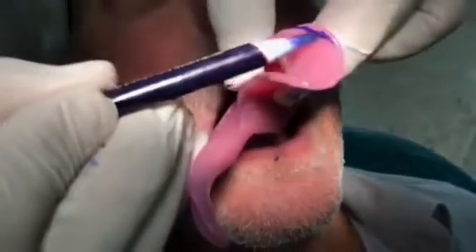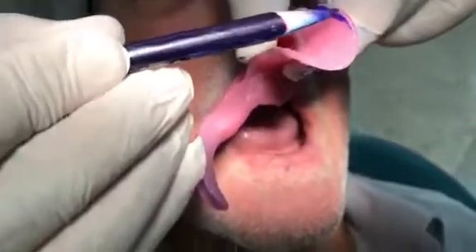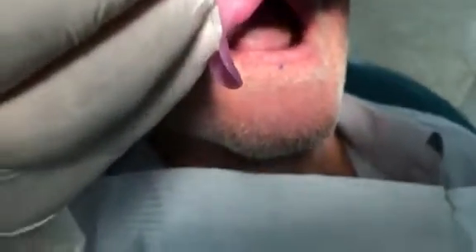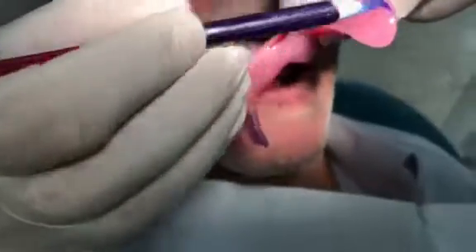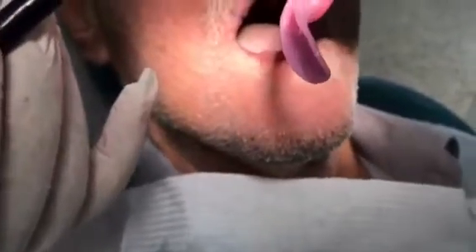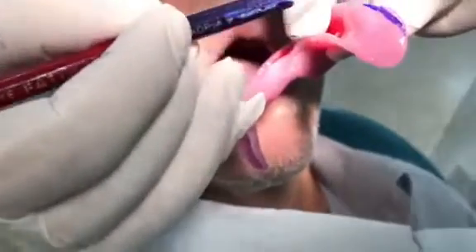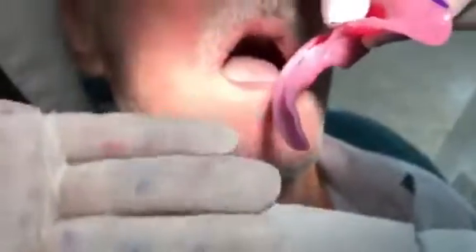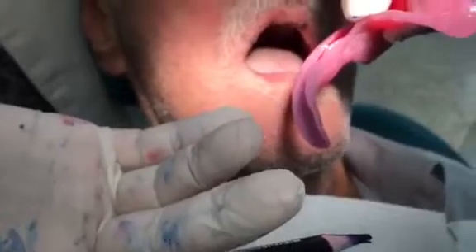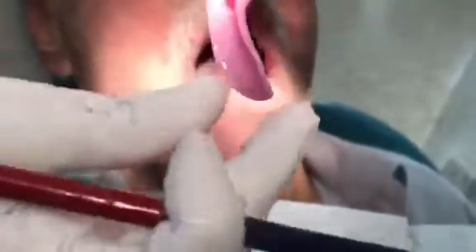That means this is going too much buccally. You might over-extend it because you want more suction and more extension in the lower — this is a case of residual ridge. But even so, what is the problem? When the patient begins opening his mouth, yawning, or moving the mouth during function, the masseter will keep bumping into this corner and will displace the denture from behind. So I need to record it correctly and trim this area away.